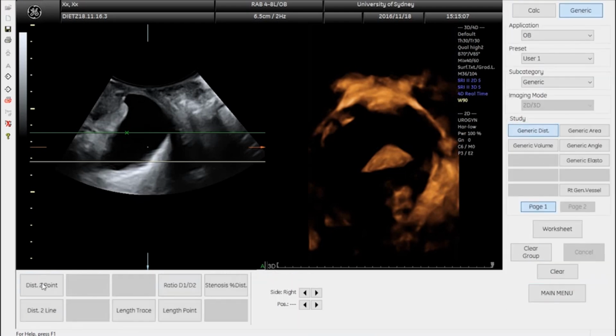We then measure the distance from that line to the bladder neck, which is about here, to the maximum extent of that cystocele, which is about here, to the cervix, which is here, and to the rectal ampulla, which is here. So what that means is that she's got a cystocele to 2.3 centimeters below, the uterus to 1.3 below, the rectal ampulla to 2 centimeters below.